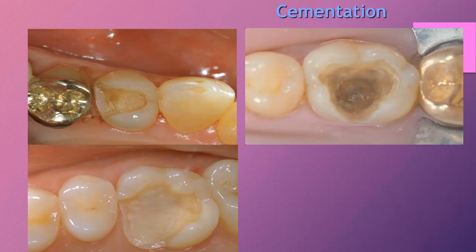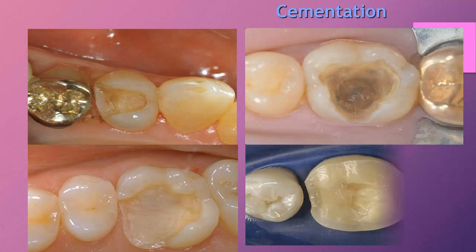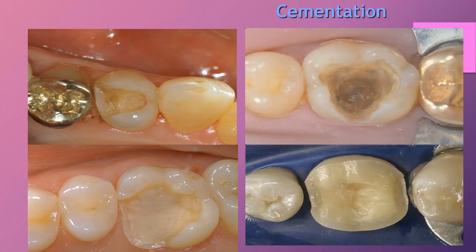All right, so we have numerous different preparation designs, from inlays that are very simple to some that are more complex, to some where we're missing cusps, until we get to the full onlay. What I want you to see here is this. You have retention in some of these, and in one you don't. So in looking at these three, there is one that specifically must have phenomenal adhesion, and it should be obvious. It's the onlay. The other three have enough mechanical retention that you could put something in there and it would probably stay in place even if you have a cement that didn't have great adhesion.